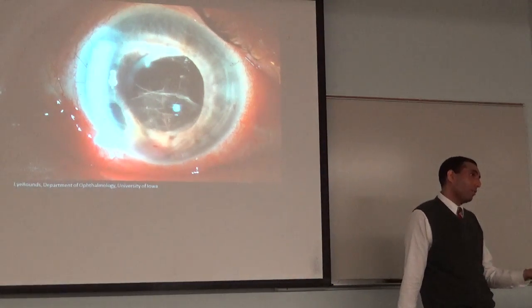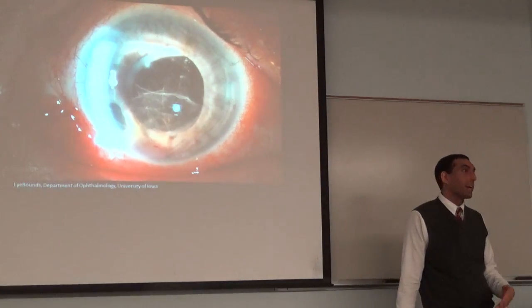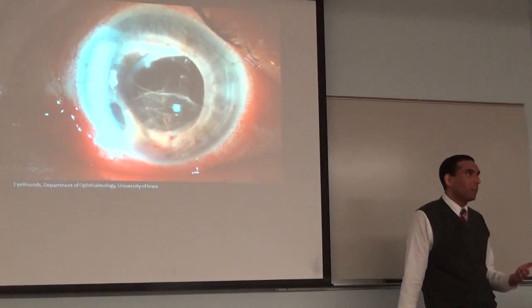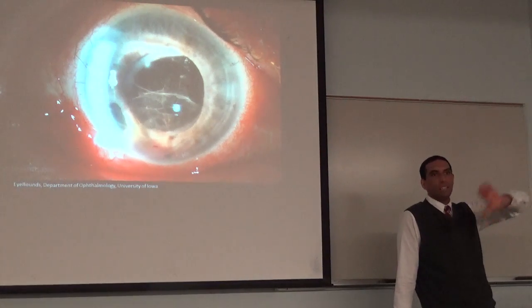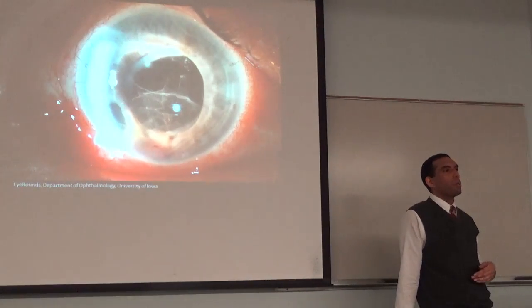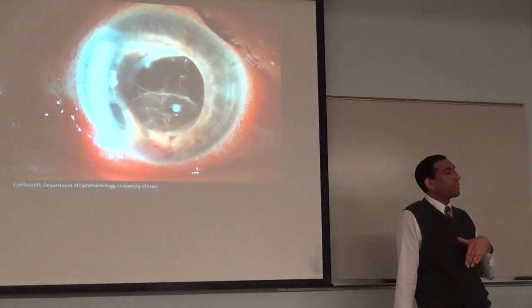So what I would love would be, so for instance, I'll give you a typical, what we call diagnostic dilemma. We don't know what something is when we look in, or even when we get the OCT. You can get inflammatory changes in the eye. So you can get a patch in the retina that looks creamy and yellow and it's clearly abnormal. But we won't know if that's infectious or if that's autoimmune. And the difference is absolutely critical.